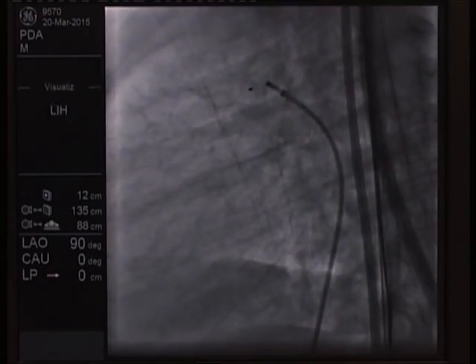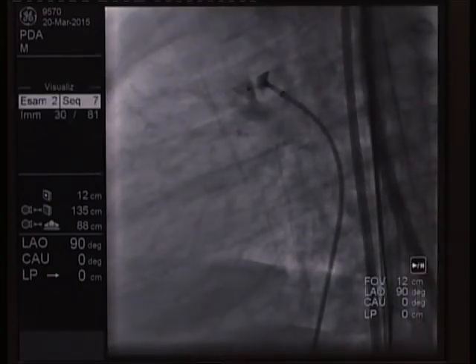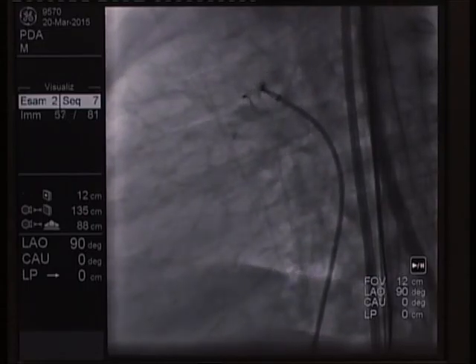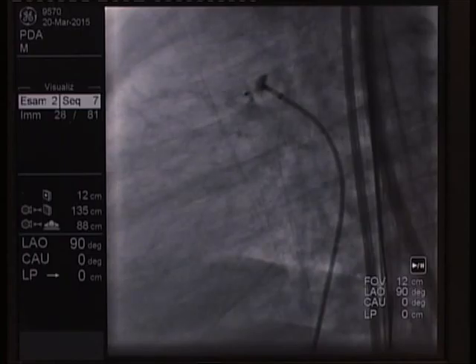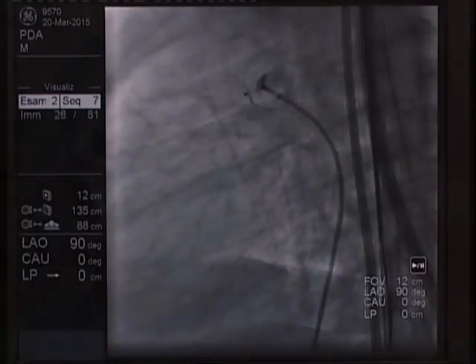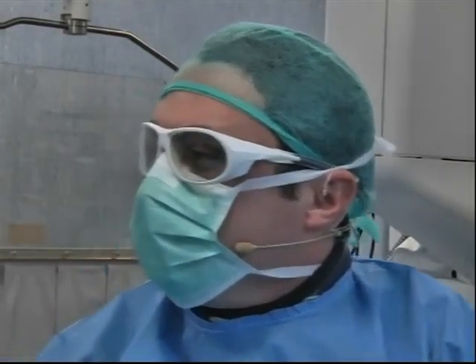So you suggest to perform an angiogram from the pulmonary artery, right? No, the question came up about the configuration of the duct, which is a type A conical duct that you showed us with the nice angiogram, with the big ampulla and the narrowing at the pulmonary entrance.